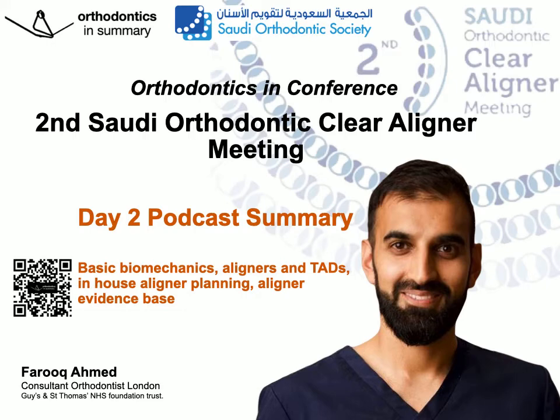How does this work? Well, initially the TADs are placed, and then the distalizing appliance is placed passively. At this point, there's a scan that takes place to produce the aligners. Once the aligners are fitted, the distalization appliance is then activated. Now, it's great from an efficiency perspective, but there are downsides, and that is having to synchronize the aligner movements with an external appliance, the distalizer. But Benedict Wilmes told us of his research and how he does it.